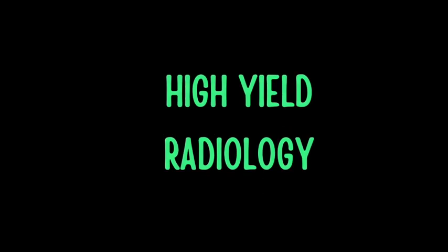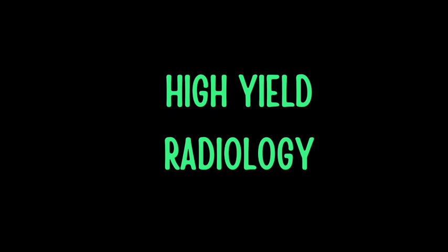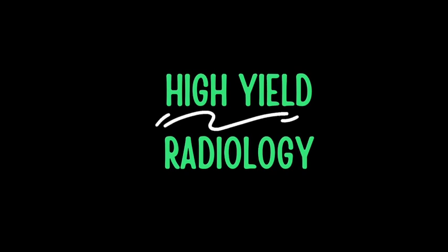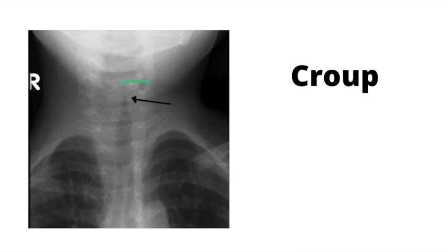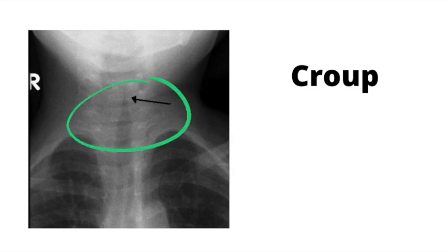Let's do some extremely high yield radiographic images and discuss the topics related to them. This is croup, most commonly seen in the pediatric population. The green circle is highlighting the steeple sign that is classically seen in patients with croup. Memorize every single image shown — they're all high yield.